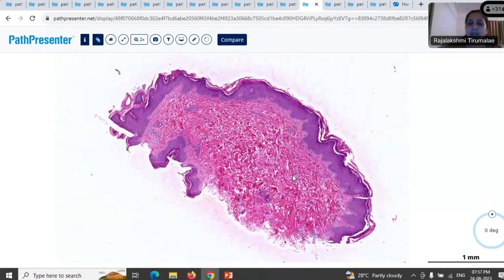All right. It's okay. Don't be worried. Just describe what you're seeing here. It's fine. What is the pattern you're seeing in the dermis? Are you seeing any infiltrate? Ma'am, the only thing is that I'm a first-year graduate, so the other things I'm not... It's all right. Don't worry about that. All of us are learning. So just describe what you're seeing here.